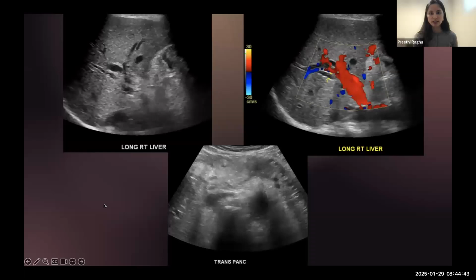And then sometimes we see too many branching tubular structures in the liver, and when we put color Doppler on, we see that they are dilated ducts. Especially if we also see a dilated pancreatic duct, we start looking very carefully midline. In this case, even by ultrasound, we could see an irregular mass that unfortunately ended up being pancreatic adenocarcinoma.